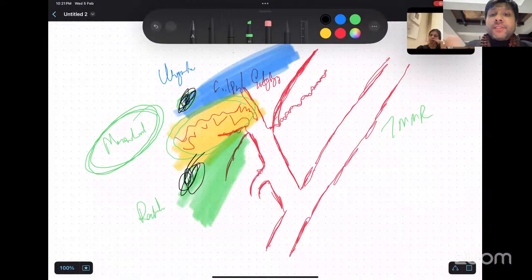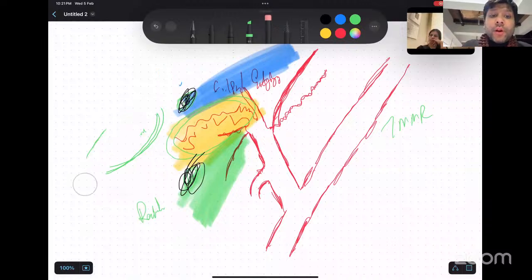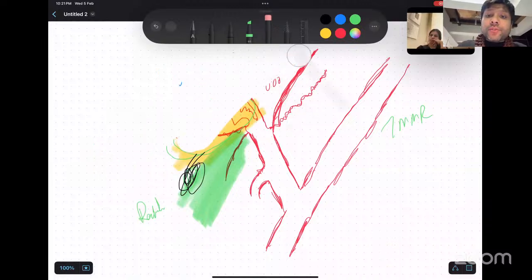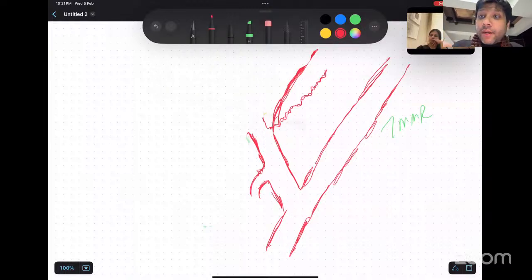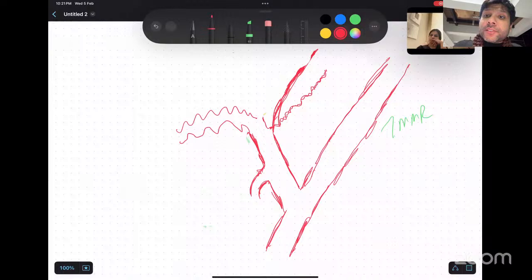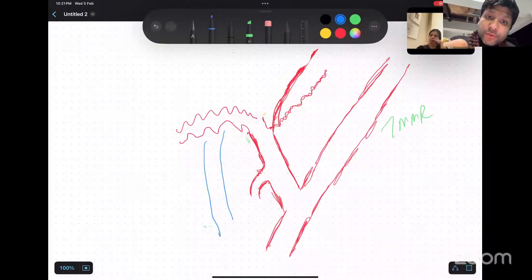Now, some clinical points after understanding so much of anatomy. If you want to cut this artery, to kill this uterine artery, the best place is to cut it at the origin, right? Unlike what Shilpa madam just mentioned, that first I will cut and then I will coagulate, actually nothing like that is done by me. What I normally do to the uterine artery is, if somebody wants to coagulate the uterine artery, the first structure which you have to dissect is this guy, which is the ureter, which is going to go underneath.